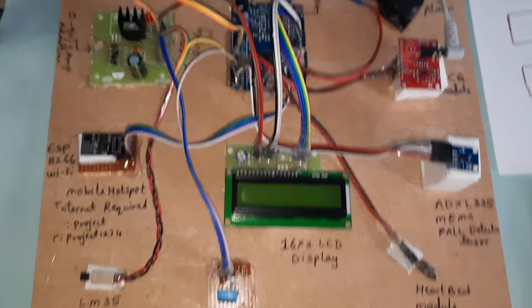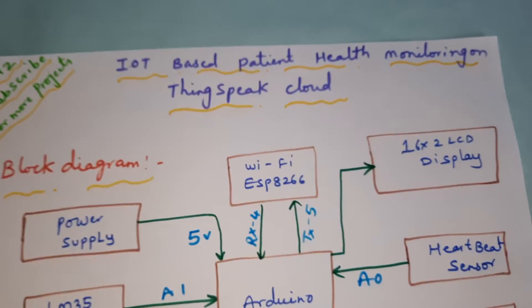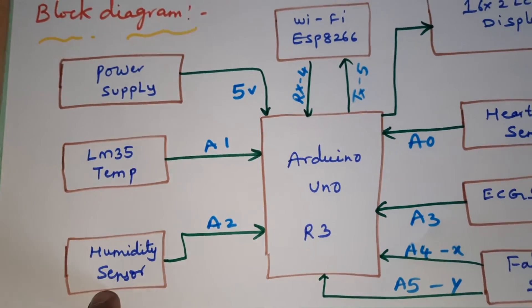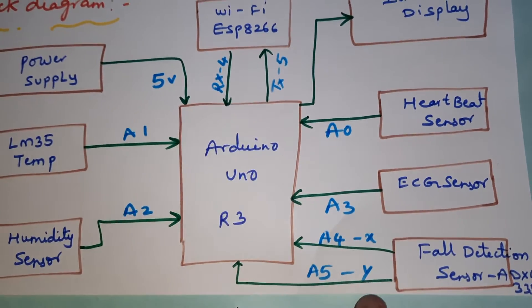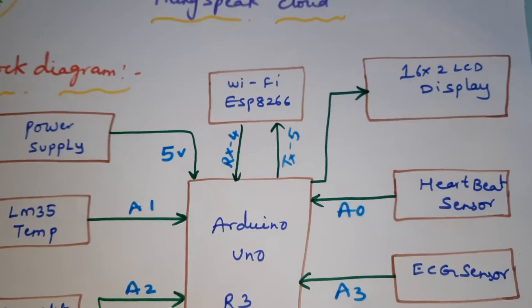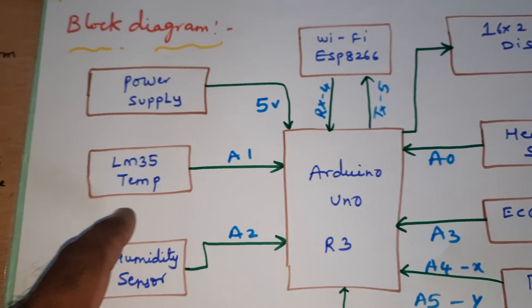IoT-based patient health monitoring system on ThingSpeak cloud. Here we are using Arduino Uno R3 board, LM35 temperature sensor, humidity sensor, heartbeat sensor, ECG module, and fall detection. We are sending the data through Wi-Fi module ESP8266 and a 16x2 LCD display.